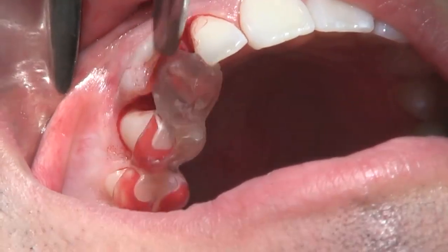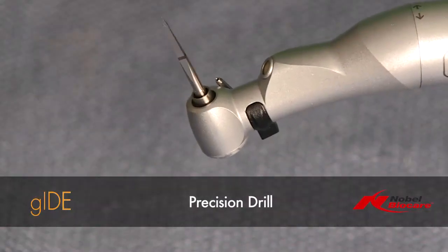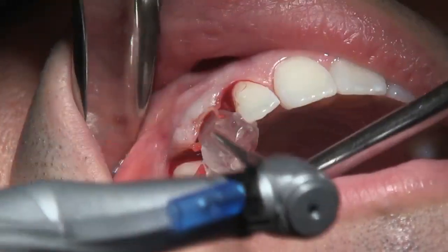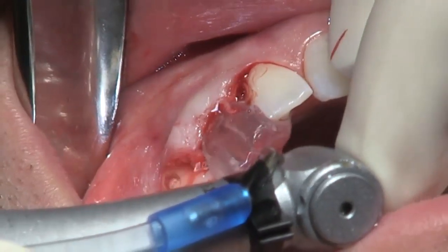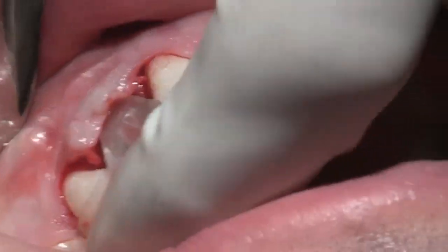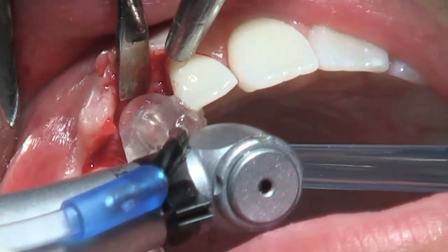The surgical guide stent is stable and applied on the posterior teeth and ready to be used in conjunction with a precision drill at 2000 RPM. Precision drill is applied exactly into the area of the surgical guide stent for the appropriate aesthetic crown fabrication later. An evaluation is done with the surrounding teeth and the bone.